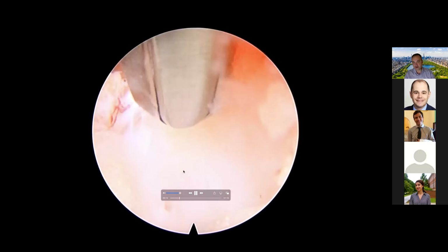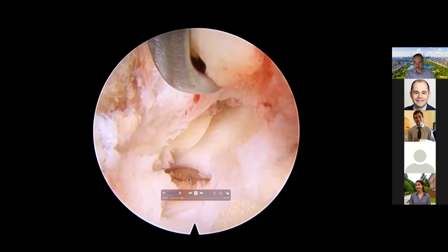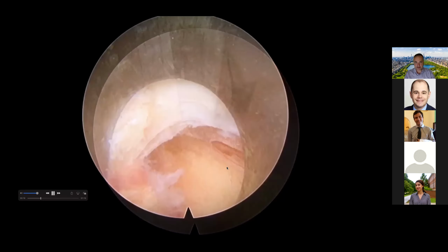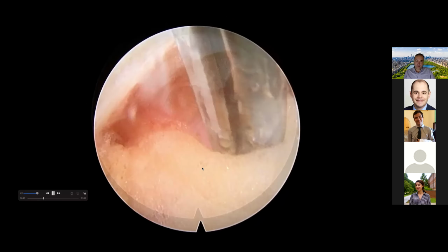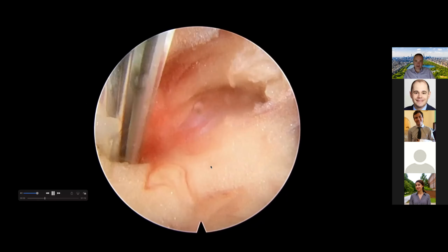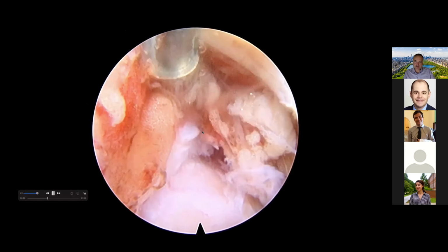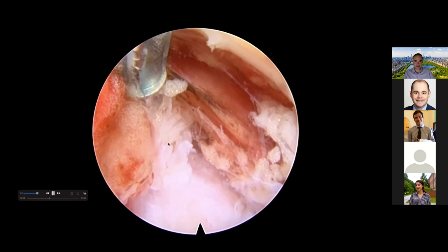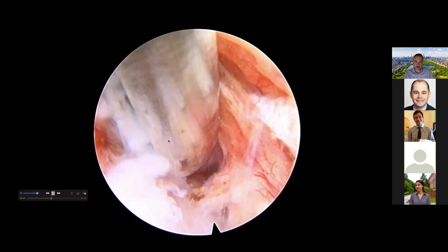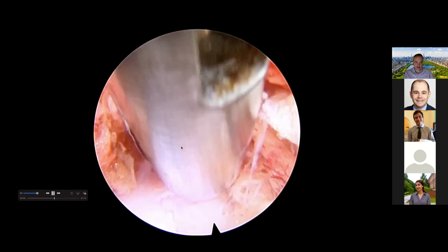And actually this tissue here is the ligamentum flavum that we are penetrating right now. And then you can see over there is epidural fat. You can see here the epidural fat. And we insert the instruments further in, and we're dissecting. And there is constant irrigation, and that's why if there is any bleeding, the blood kind of obscures our field of view. And over here, you're seeing that we have identified the disc herniation, and we're removing that.